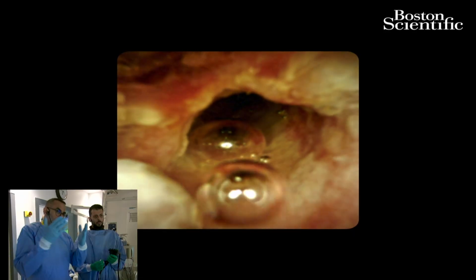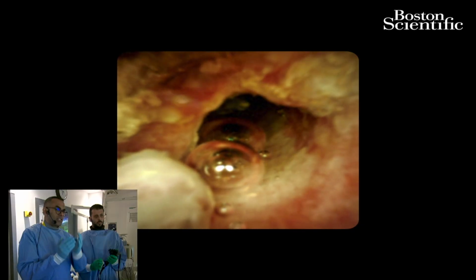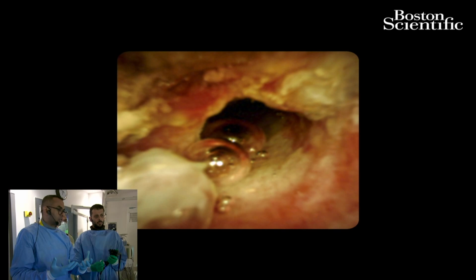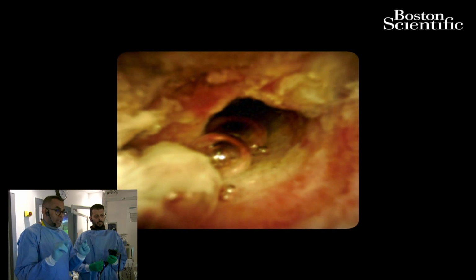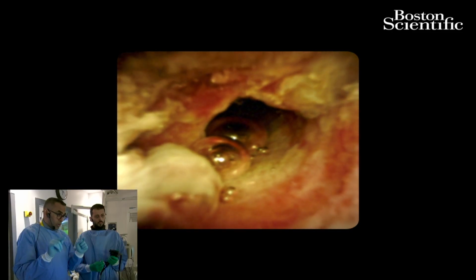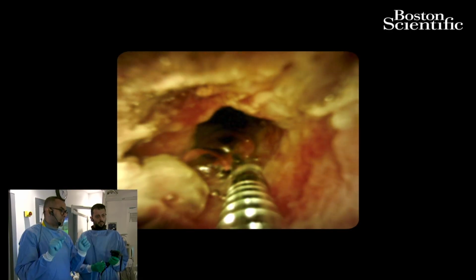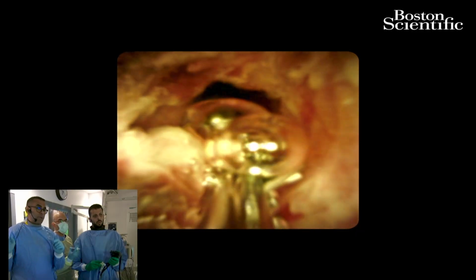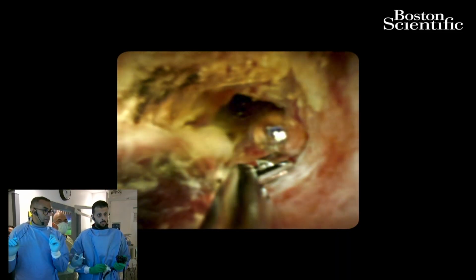I also see that the lesion itself is not actually circumferential. It's on one side of the duct. That's not usually what we commonly see in cholangiocarcinoma. Another thing to add is that the stricture is located exactly at the level of the cholecystectomy site, the clip. If we could refer back to the fluoroscopy image, if we could just fluoro, yes.